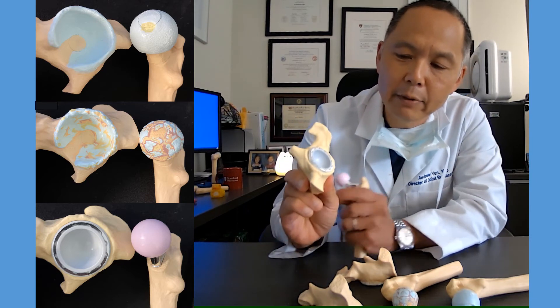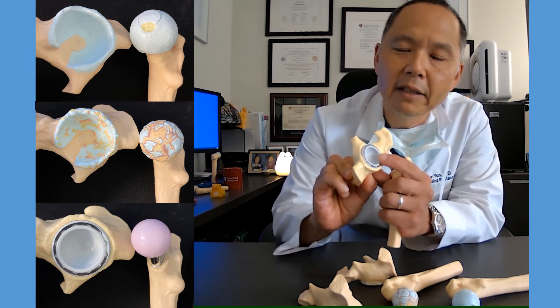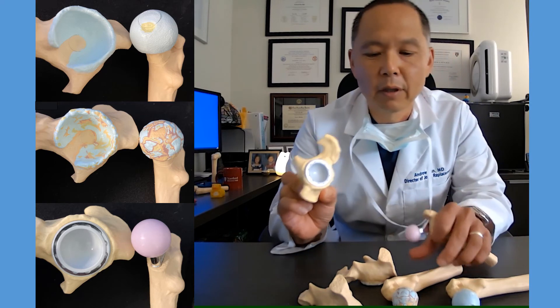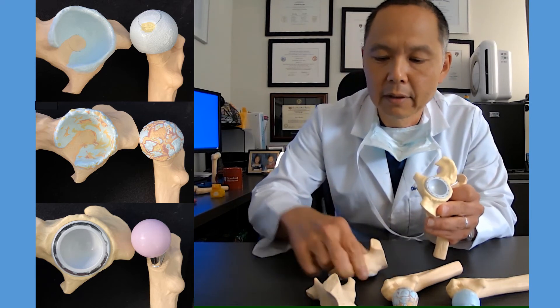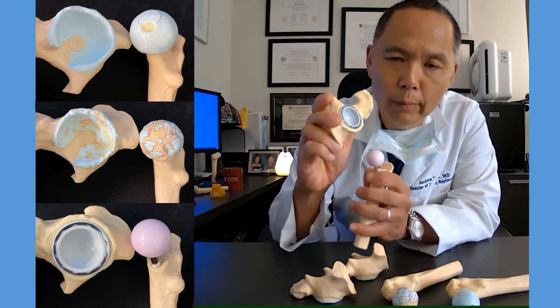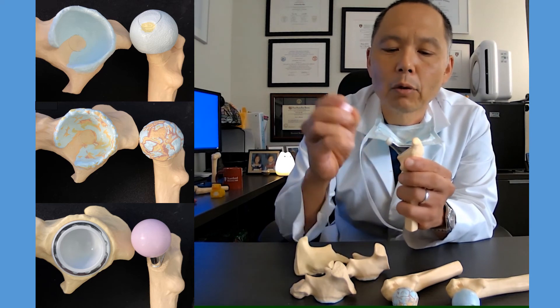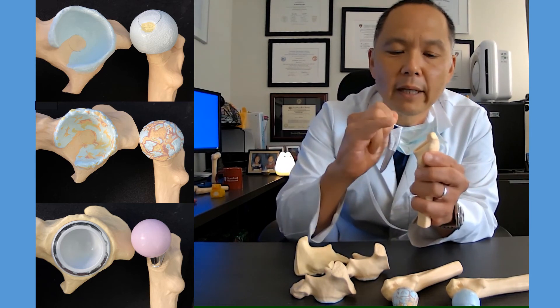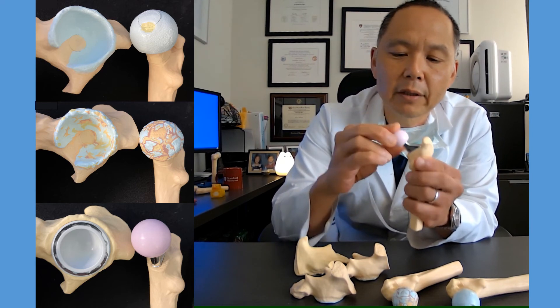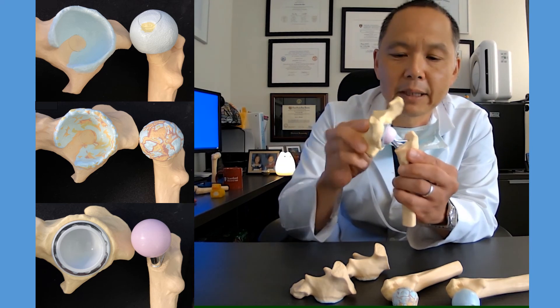On the acetabular, the pelvic side, we're going to put in a cup. That cup contains the polyethylene liner. That polyethylene liner will be the substitution for the cartilage — it will absorb and transfer the load between the bones. On the femoral side, we remove the ball and the neck so that we can put a stem down the canal. That stem is there to hold the ball in the appropriate position. And that is a hip replacement.